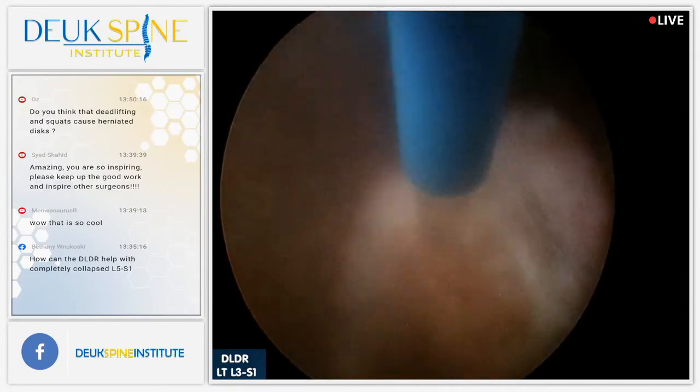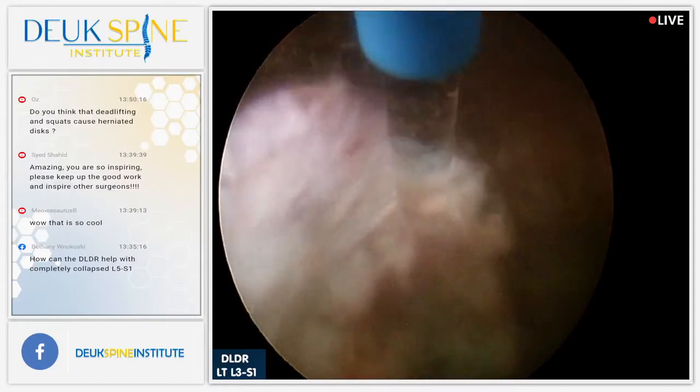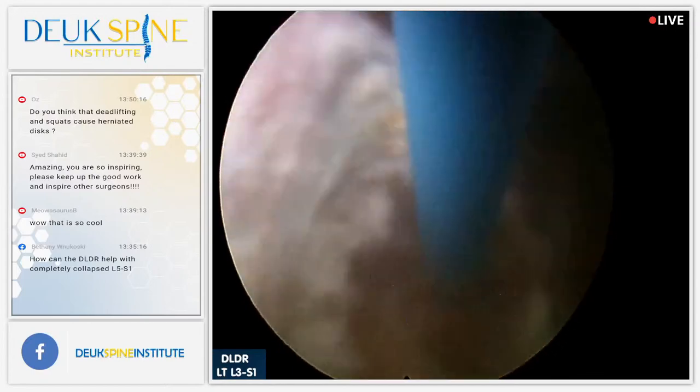We're pretty much done. I'm going to just look right here, make sure. The flashes of light are from bone spurs, which we're not taking out because they're not causing any problems in this particular patient.